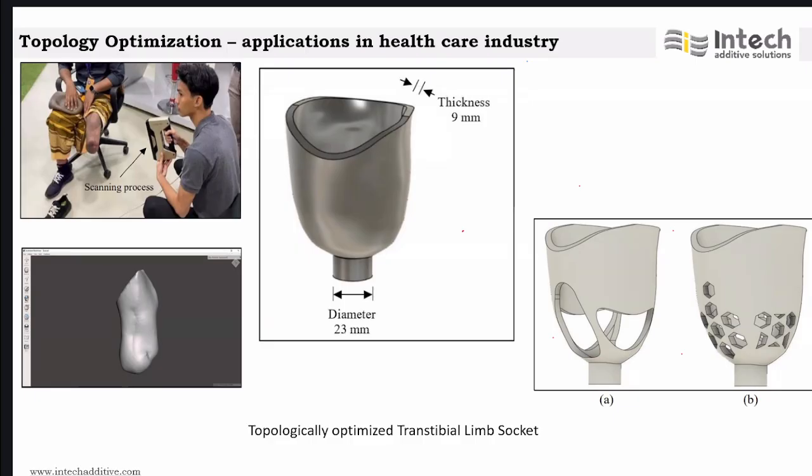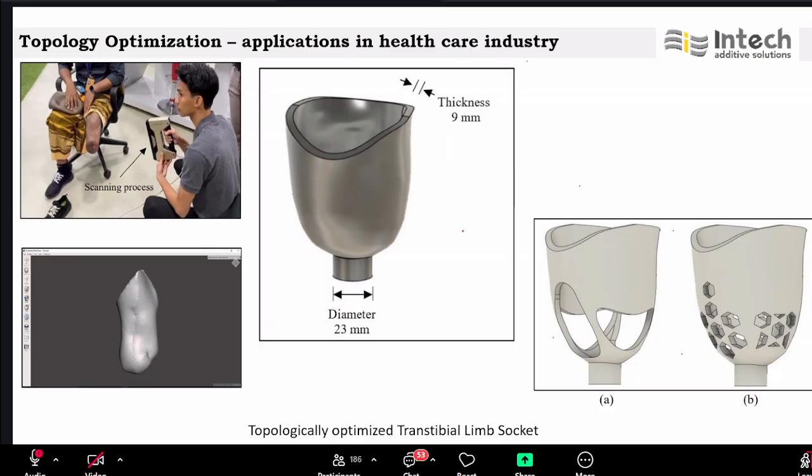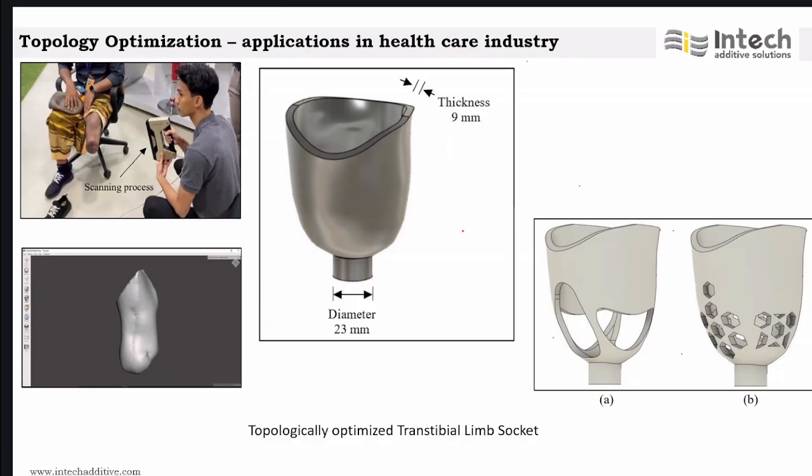In implants, you have this concept called stress shielding. So how do we reduce the bone loss by going with customized implants? That has been a big challenge. So how do we go around that? How can we reduce that? We should not remove too much bone, so how can we prevent that? That we can just think.